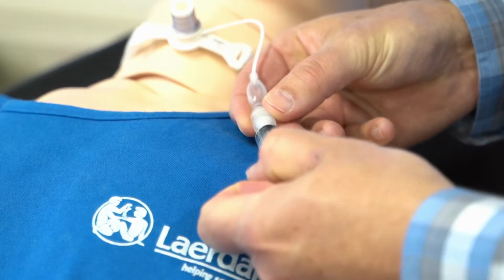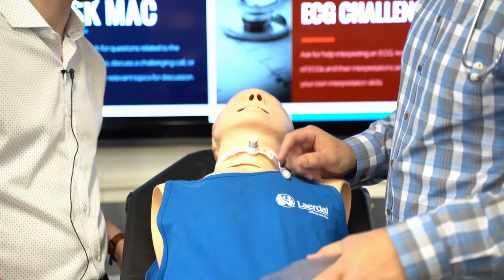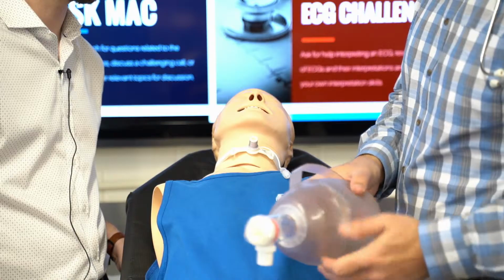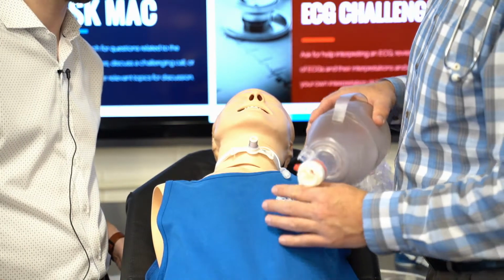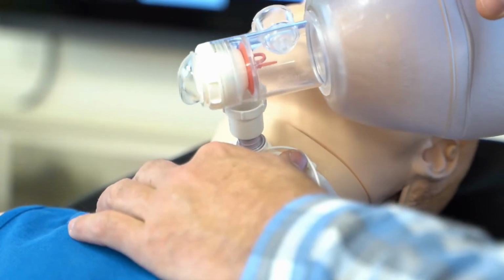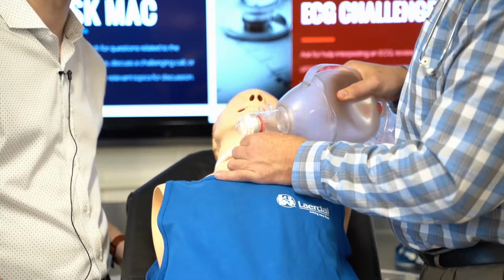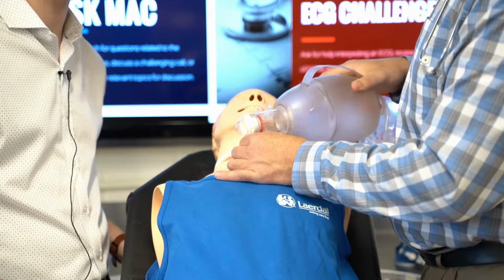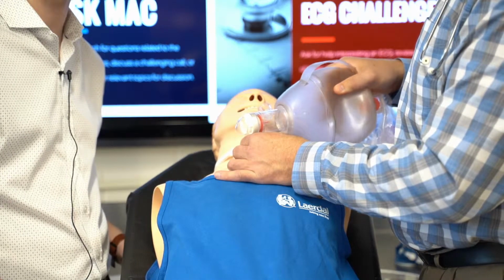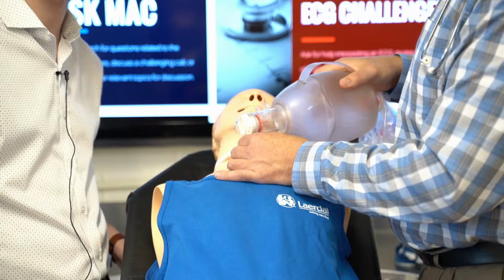And then, if we haven't already done so, we're going to remove our HMEs, our one-way speaking valves, or our inner cannula if it's obstructed. And then we're going to attach our BVM to our 15mm adapter and ventilate. What's important to note is that with some types of tracheostomy tubes, the inner cannula has to be in place to put a BVM onto the 15mm adapter.